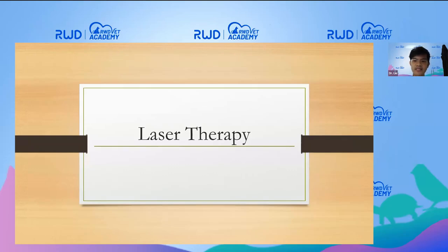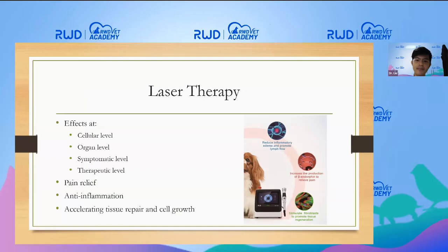The next part is laser therapy. Laser, or light amplification by stimulated emission of radiation, is a means of directing highly concentrated coherent light at a concise wavelength to the muscles, tissues, organs, connective tissue, formed elements of the blood and the living matrix of the body. Laser light then communicates to the cells on a very basic and powerful level.